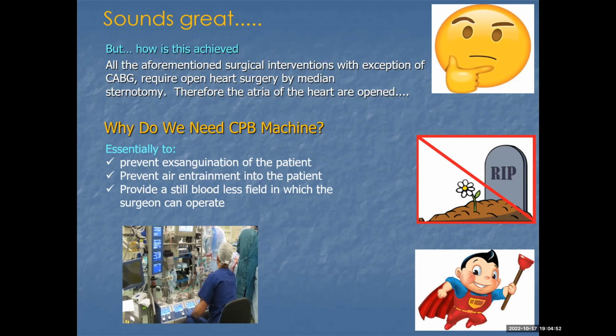The reason surgeons moved away from using the cardiopulmonary bypass machine for this procedure is that they thought it was better for the patient, because the immunological response would be much less. But as time has gone on, and it was a bit of a fashion really, we realised it's not the heart-lung machine that produces a lot of the inflammatory response and activation.